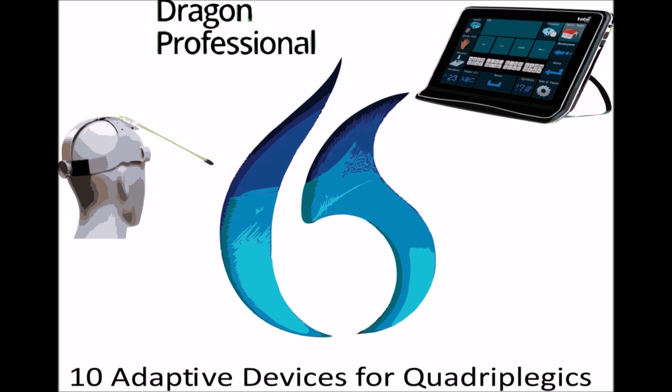They can also be fitted with additional accessories, such as oxygen holders, cup holders, and storage compartments, to enhance the user's comfort and convenience. Overall, electric wheelchairs are an important assistive technology that can help individuals with disabilities to lead more independent and active lives. They can improve the quality of life for individuals with limited mobility, allowing them to participate in their communities and engage in a range of activities.